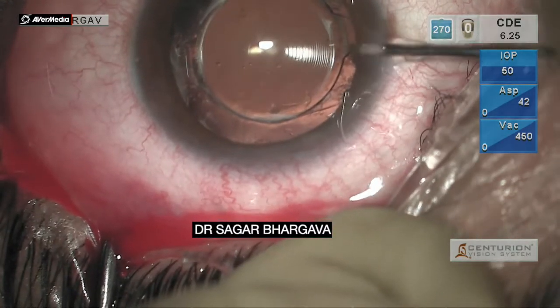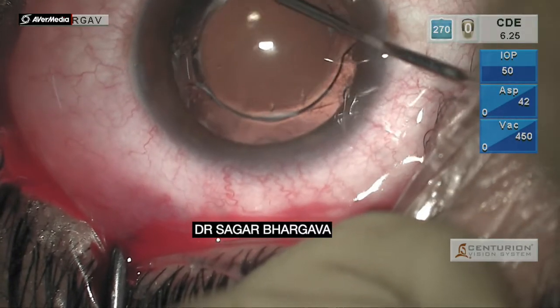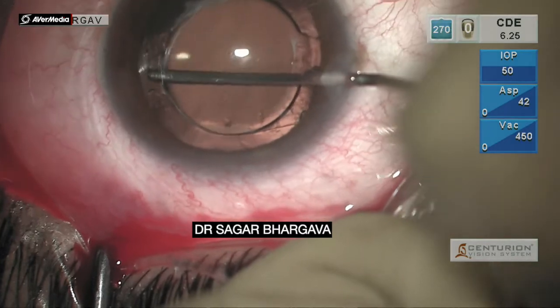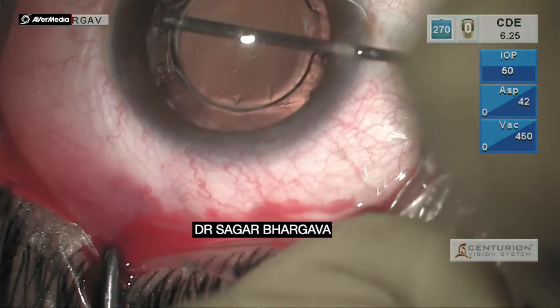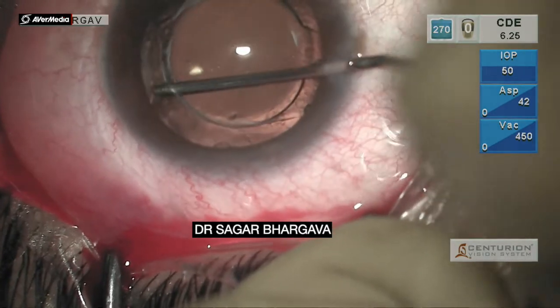As the anterior capsule was fused with the posterior capsule, a spatula was used to create a plane between the anterior capsule and the posterior capsule. This was done from both sides — nasally and temporally.